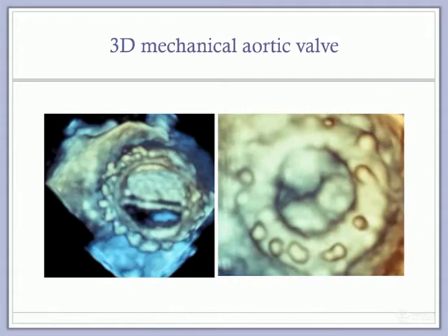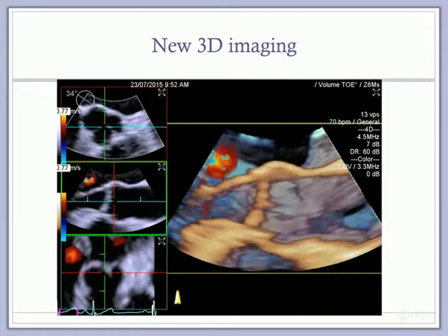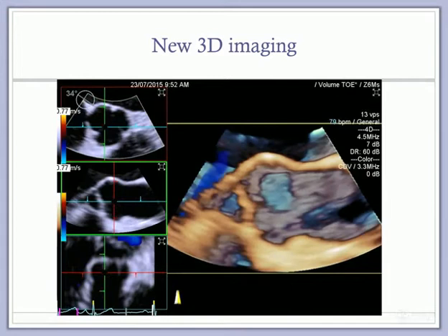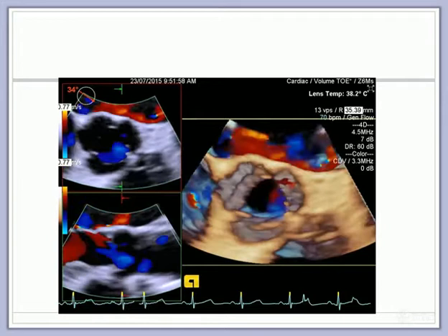Okay, this is a clip from the new Acuson 3D probe that was delivered to us on Thursday, and it's not gated, and the colour Doppler is quite amazing. Promises to be quite useful in defining the regurgitation and the mechanisms causing it, as well as enabling accurate measurements. Unfortunately, the only patient we got to use it on was someone having a mitral valve repair, and they had no aortic pathology, so it really just shows up a normal aortic valve. But I think we'll be using it a lot more.